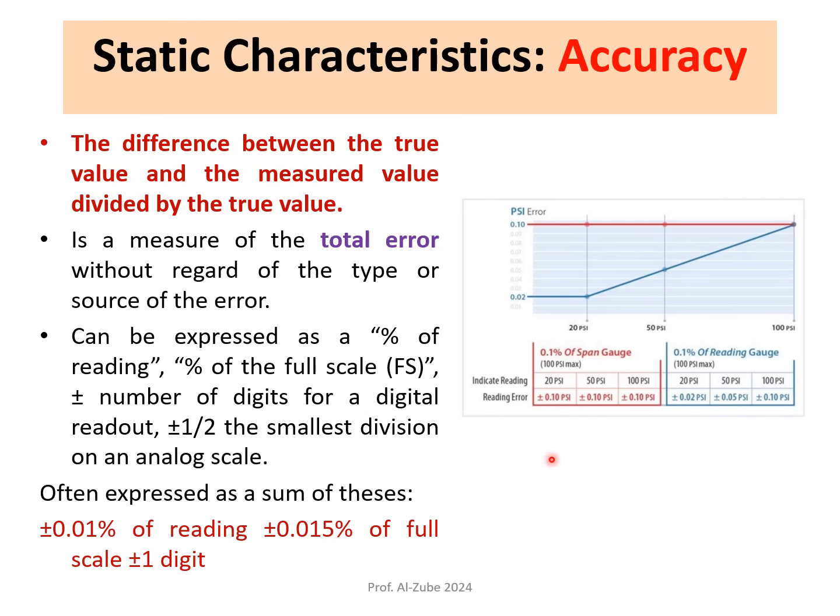So that's something to look at when you try to compare between two different medical instruments, and see the performance of these medical instruments. You want to make sure that the value, the percentage error, is as small as possible, and that means that it's a good instrument, and that's going to be an expensive instrument.